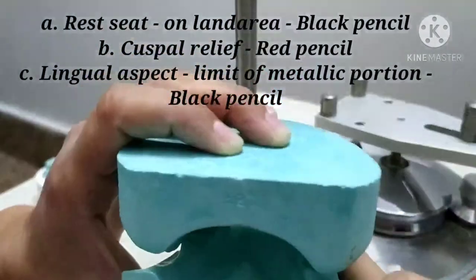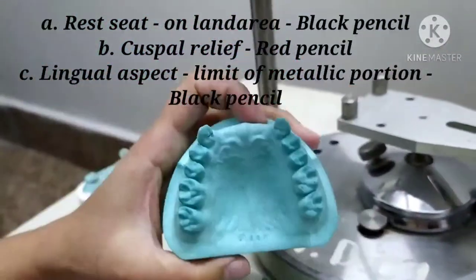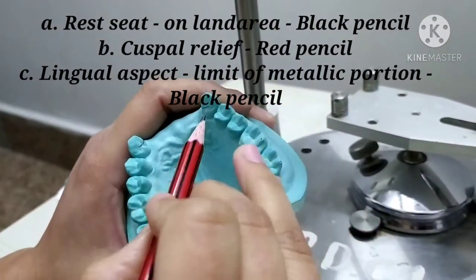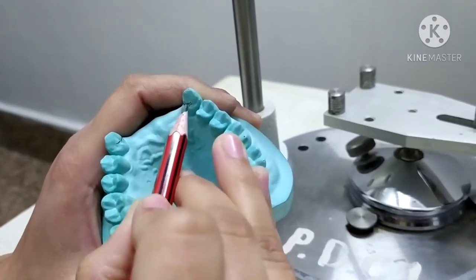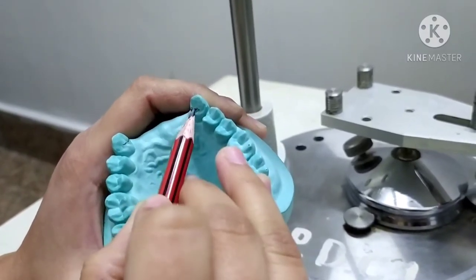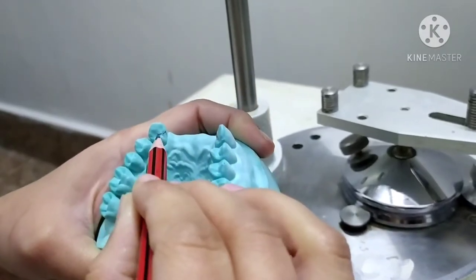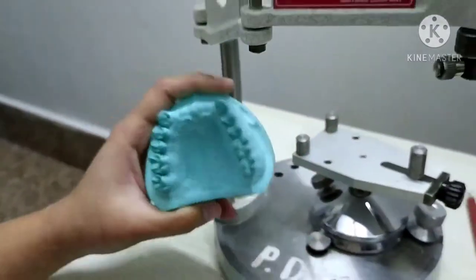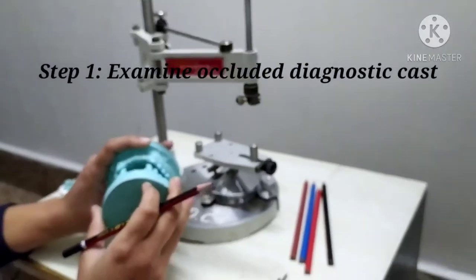This line shows the incisal limit of the proposed metal extensions. As marked here, only up to this point should the metallic portion of the framework be extended — it should not go above this. These were the steps for the first step of examining the occluded diagnostic cast.